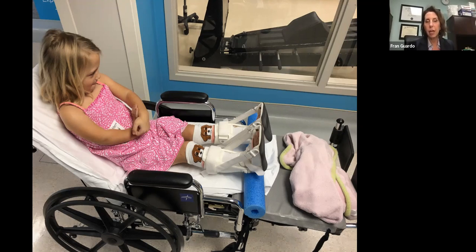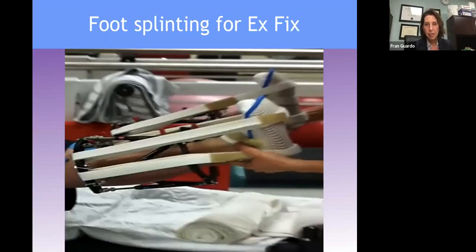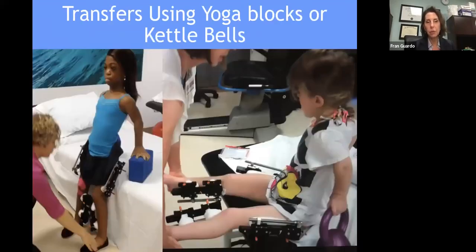And this is an example of a custom dorsiflexion splint for somebody undergoing a tibial lengthening. This photo is the splints that our team makes, our great OTs make, for the support of the feet. And they use these while sleeping at night and while resting. And they have just Velcro straps to maintain them. This is an example of the push-up blocks that we use, and also kettlebells.